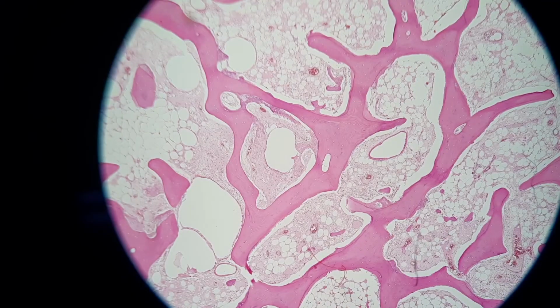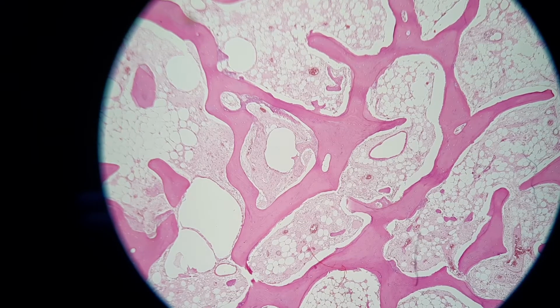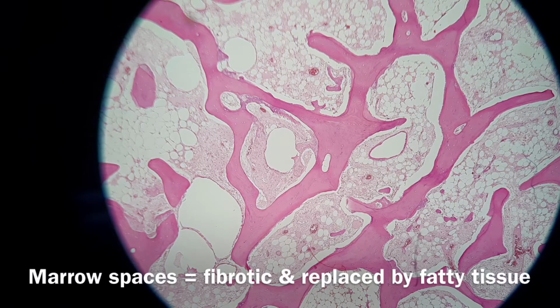Okay, guys. So today we are going to learn the features of metastatic carcinoma of the thyroid to the femoral head. So this is a section or tissue from the femoral head. As you can see, there's a lot of bony trabeculae, and the marrow spaces are a bit fibrotic and contain a lot of fatty tissue.